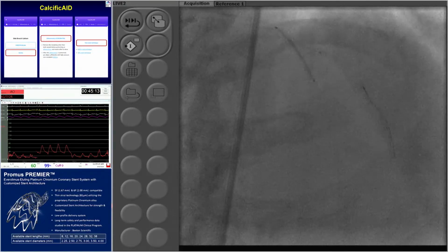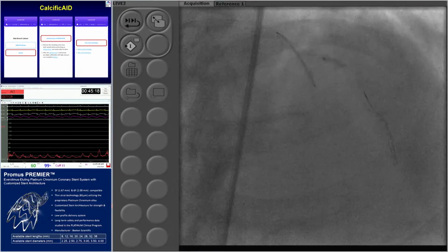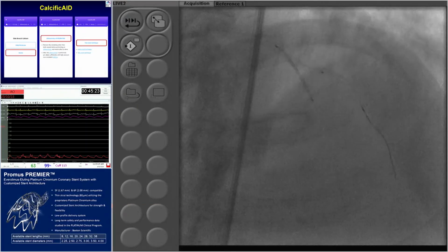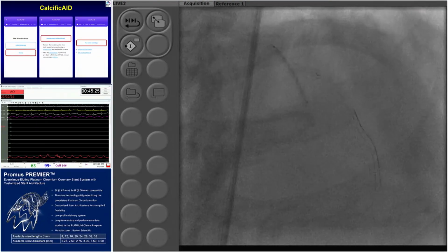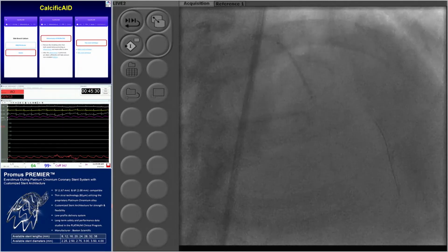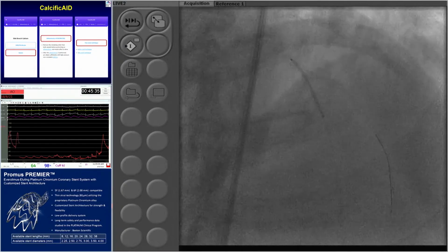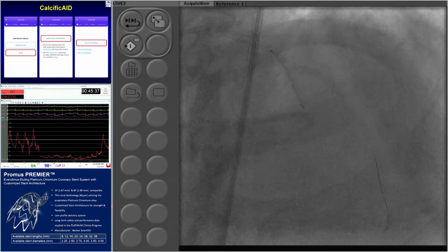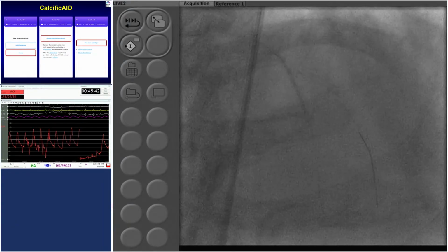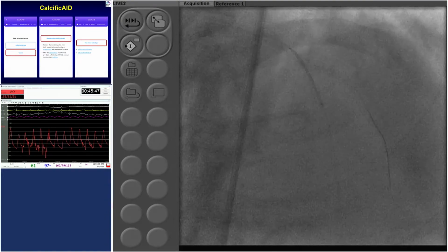I think the big question that everybody has is how do you decide to do rotational atherectomy in that side branch? Weren't you concerned when you saw a disrupted diagonal to go again with the rotational atherectomy there? Most people would not, but I can tell you this, if you want to do something to this diagonal, which has such heavy calcium, without rotational atherectomy technique you'll never be able to expand the stent. Guaranteed. Now the wire in the diagonal is out, so that's done.